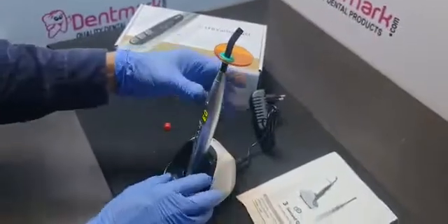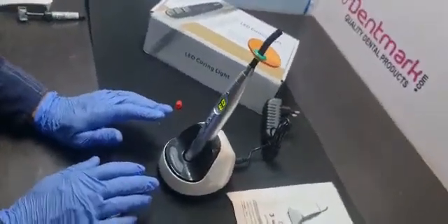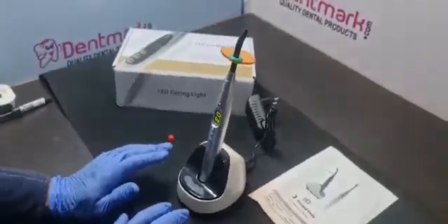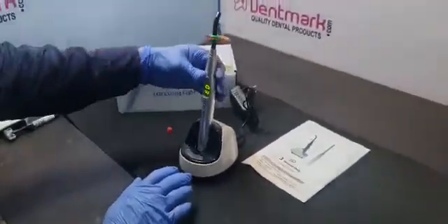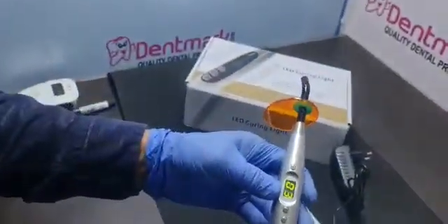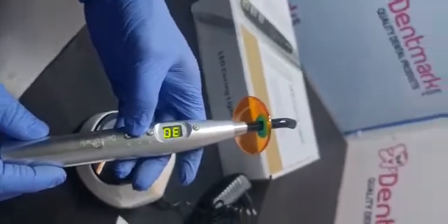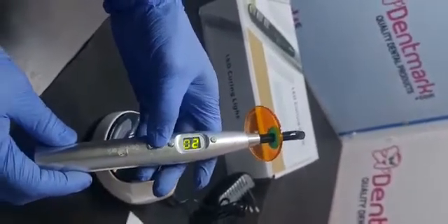How to test the charger — it has a battery capacity of 2600 mAh and the intensity is more than 1800. It has a special system; in this curing system, the time is from 3 seconds to 40 seconds, as you can see.